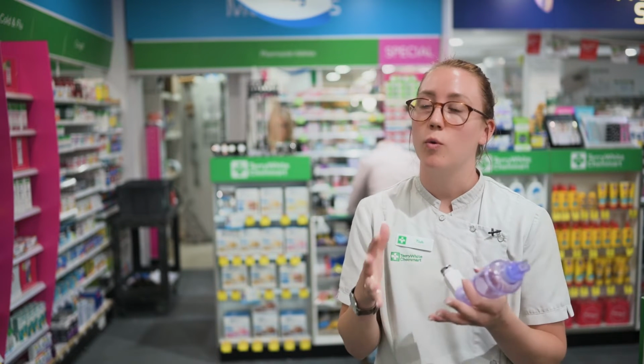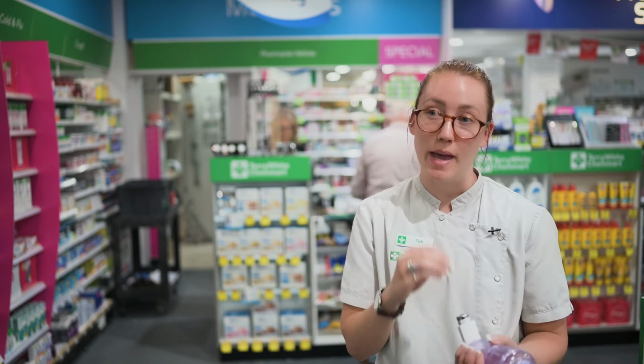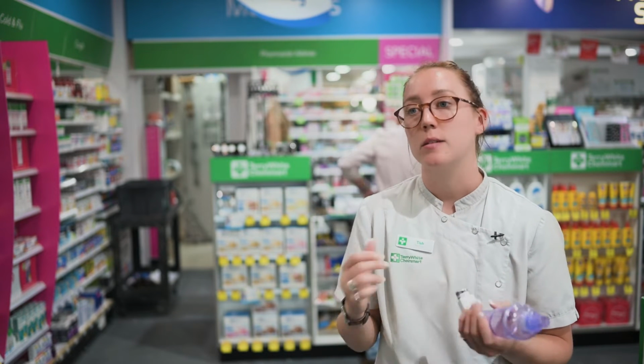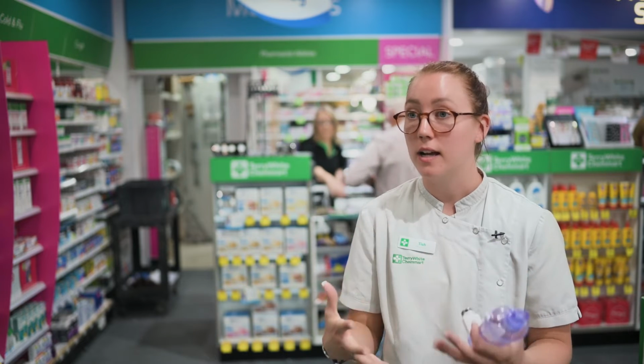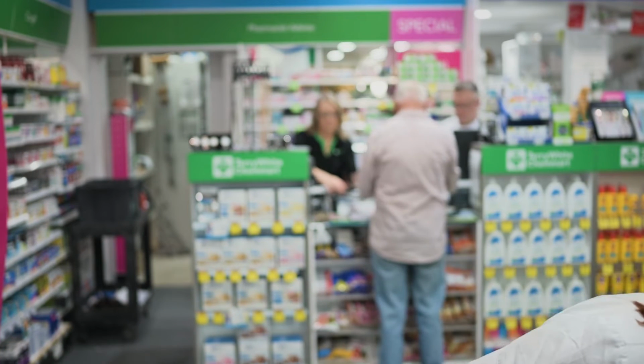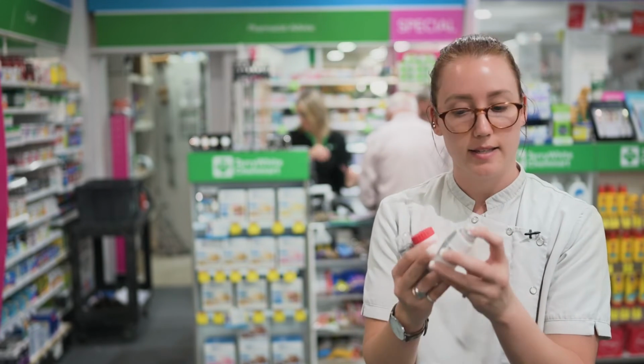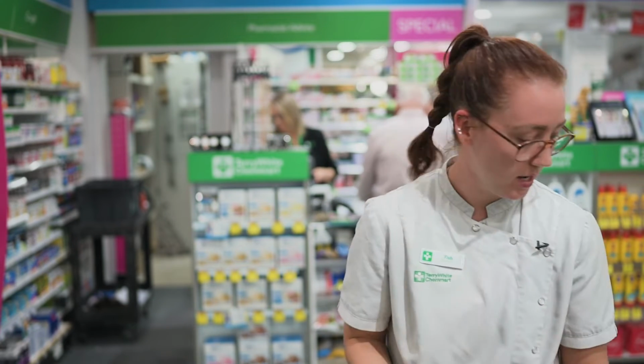It just depends what medicine's working best for you, which puffers you need to use. Some have got powder in them, some are sprays, and it depends on the person and how their lungs are and how they would prefer to use a puffer. So we've got, like I showed you before, the spray. So that's a preventer. Same way, take the lid off and you spray.